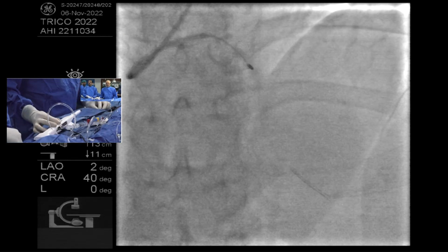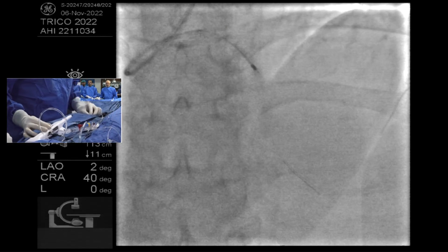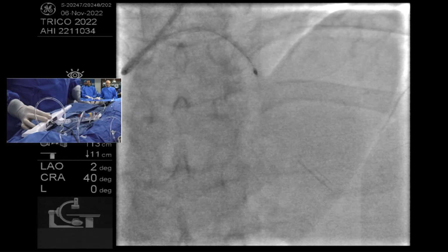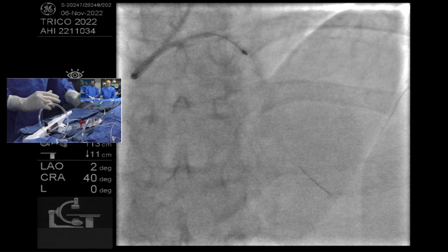It's moving. It is going little by little. It's going to take another 3 or 4 passes. There we go. I'm happy to be wrong.